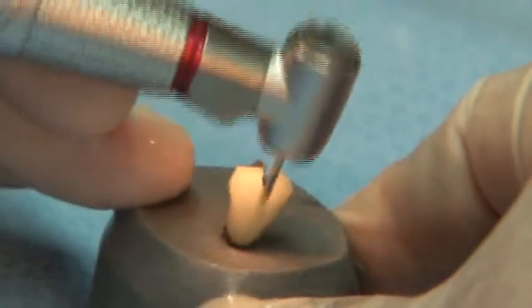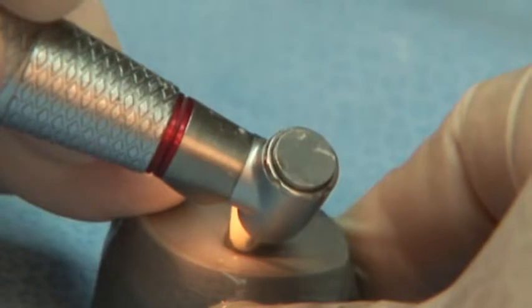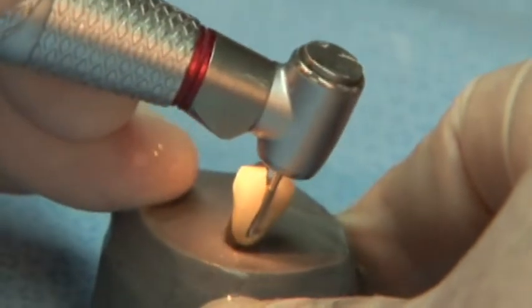Since saving time and money is so important, the Great White Gold Series is the one carbide burr your office cannot be without.